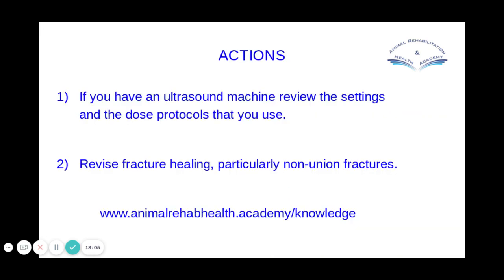So just a little recap then. That's it for today. You've got your shortwave ultrasound between 1 and 3 megahertz, which is your most used. You've got then long wave ultrasound, which is 45 kilohertz, which is all about the same thing as the shortwave ultrasound, but it's a different frequency. And then the other type of ultrasound that you will see is LIPUS, low intensity pulsed ultrasound, which is currently being used for fracture repair. It probably will be good for other stuff, but at the moment, that's what it's being used for.